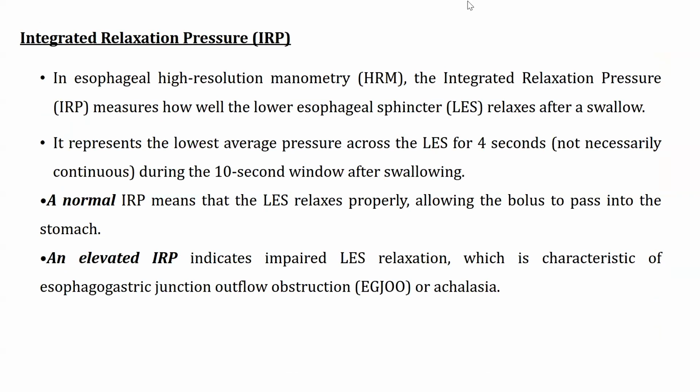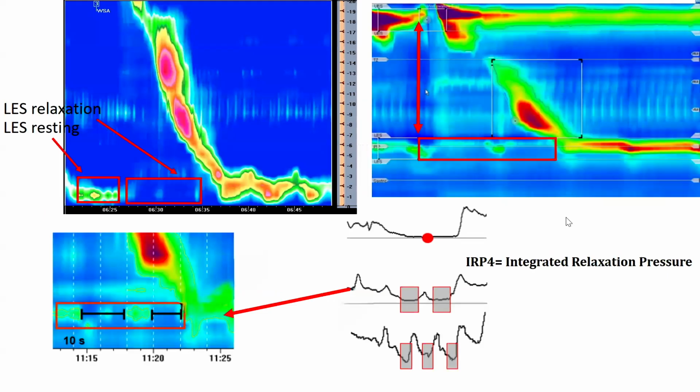Let's move to the next slide that explains what the IRP is and how the software makes the calculation for it. Let's see here on the top right.